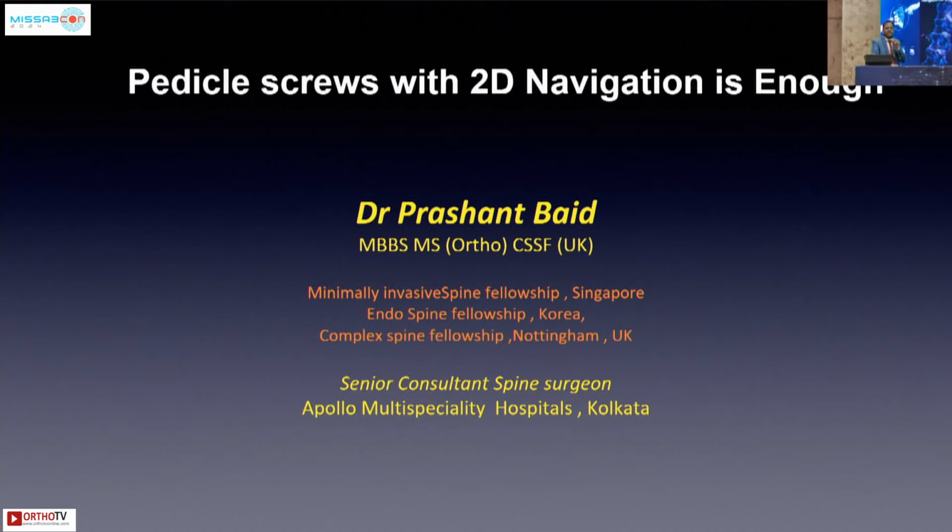But I think in the changing scenario, Dr. Abhinay normally does a lot of open surgeries, not MIS surgeries. I'm not sure whether his talk is relevant to MIS surgery. Nonetheless, as time is changing, we are doing more and more MIS surgery, and I think the freehand technique is out of bounds in MIS, in open surgery. So you have to do some sort of either X-ray based or navigated surgeries.